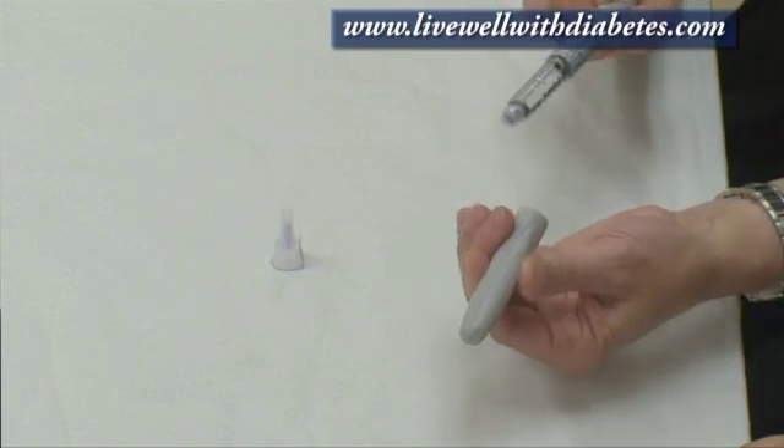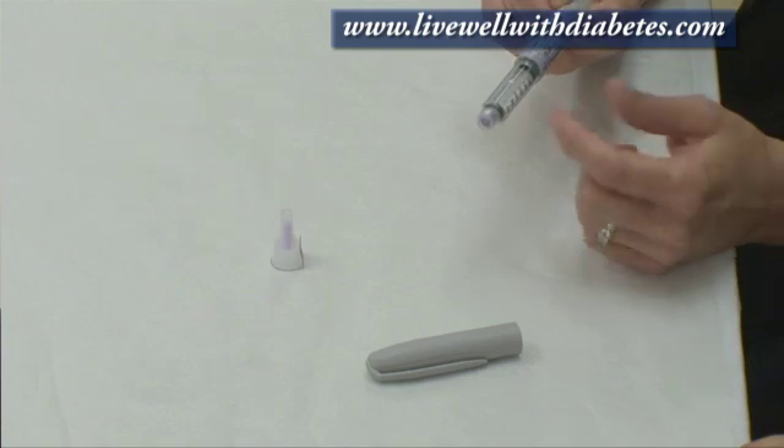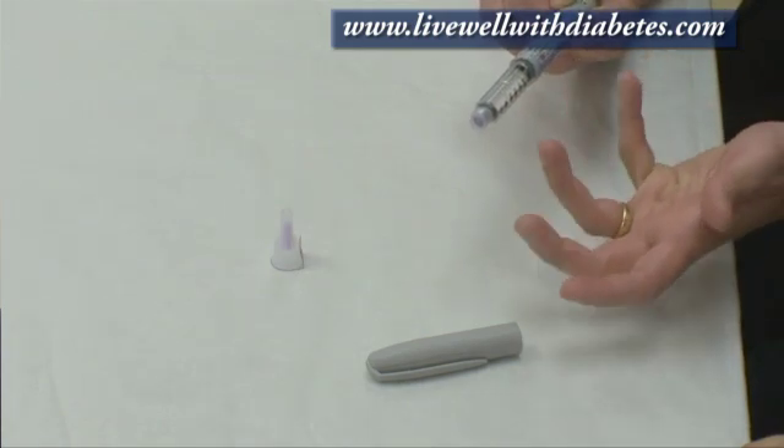Shama, I understand the doctor has asked you to start on the Lantus Insulin. Lantus Insulin can be used with what's called the SoloStar Pen. This is like a regular pen and it has a cap on it — just pull the cap off. What's interesting about this pen is that it comes pre-filled, so this clear liquid here already has the insulin in it.